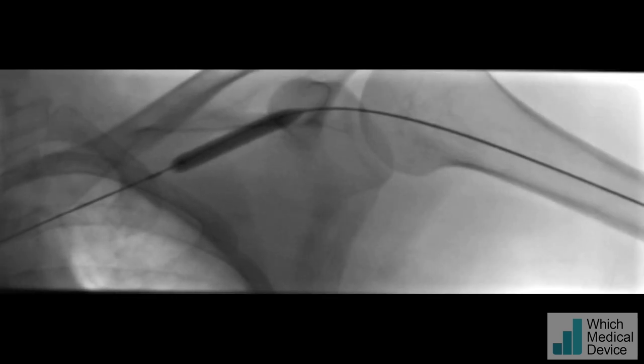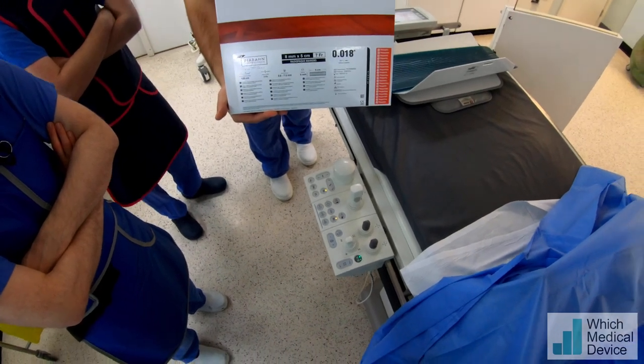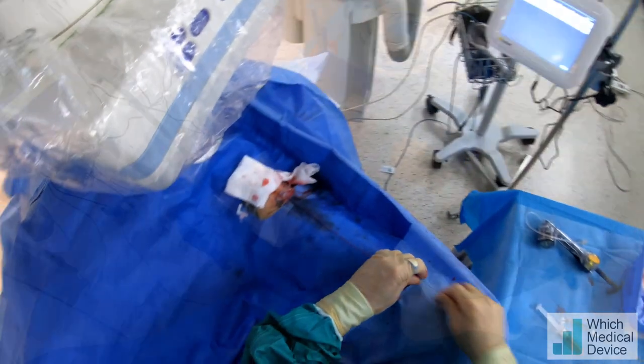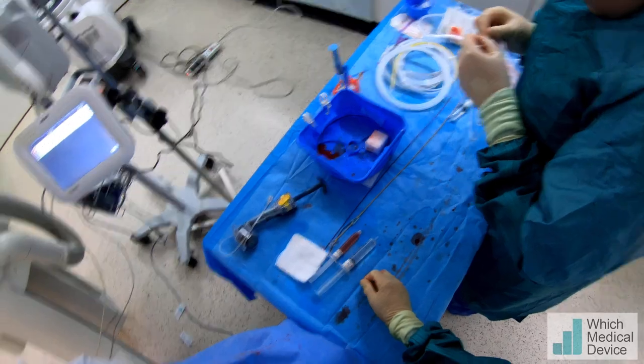You can see now that waisting has gone completely. The Viabahn stent we're going to place is eight millimeters by five centimeters and it's over an 0.018 wire, so we're going to insert a V18 0.018 wire which should give us enough support to place this stent. This is the Gore Viabahn stent — we're just going to insert over this 0.018 wire.